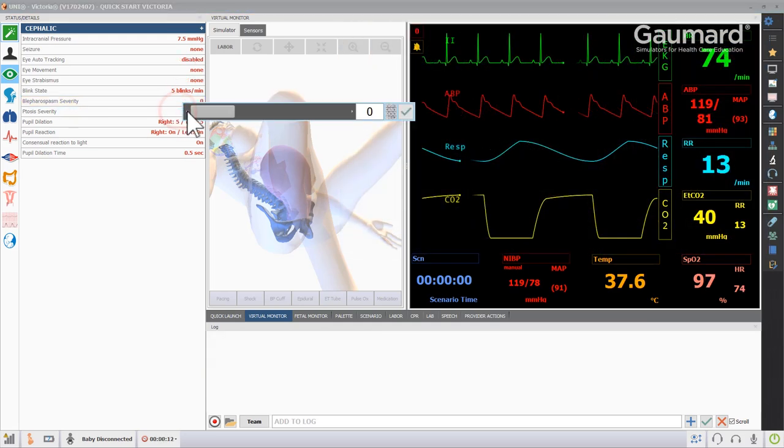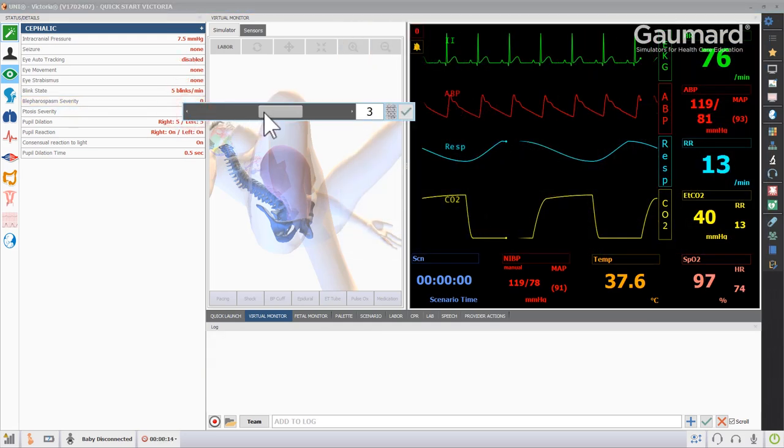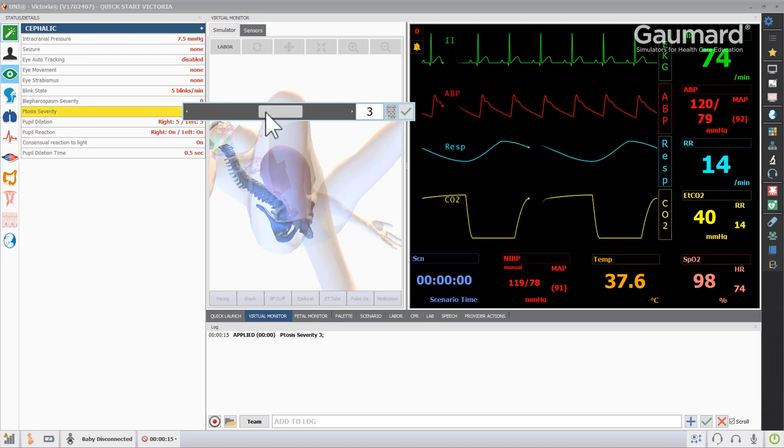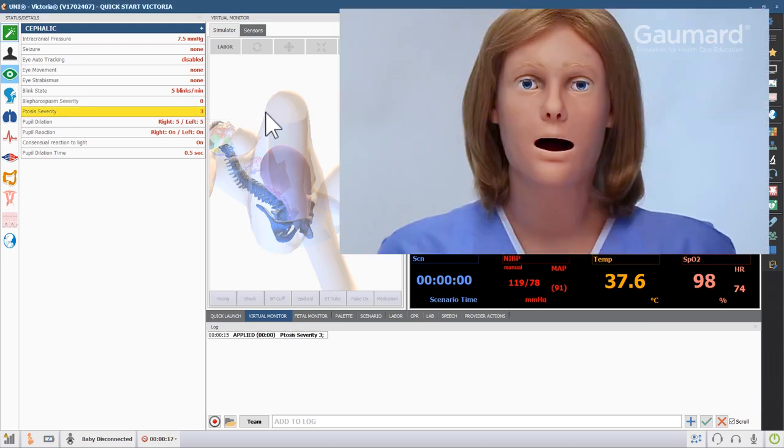The eyelids can be programmed to droop by clicking the ptosis severity and moving the slider to the right to increase the intensity of the droop.